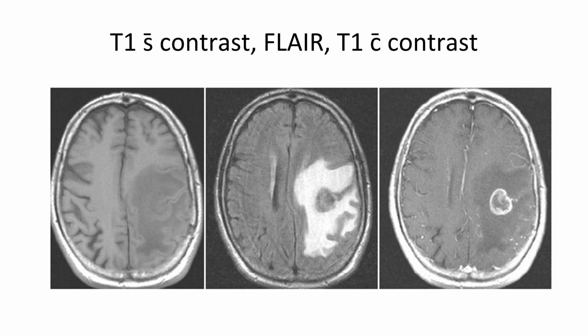But the clues that indicate this is in fact an MRI are, one, even the skull itself shows a lot of detail. You can see this sort of intralaminar membranous formation within the skull itself. And then also the brain tissue is highly detailed, much more so than a CT scan. So those things will give it away.